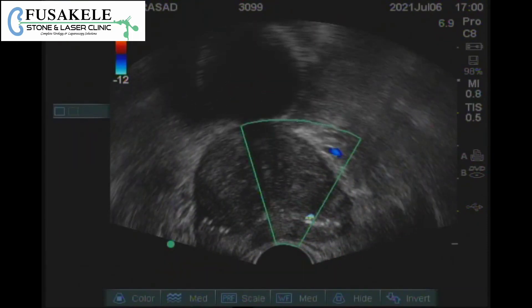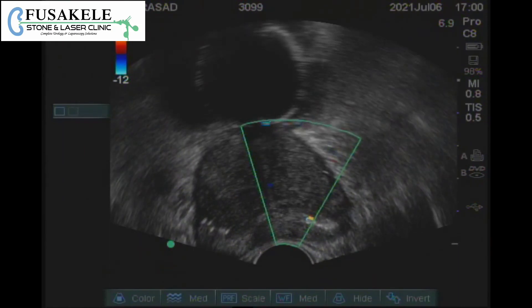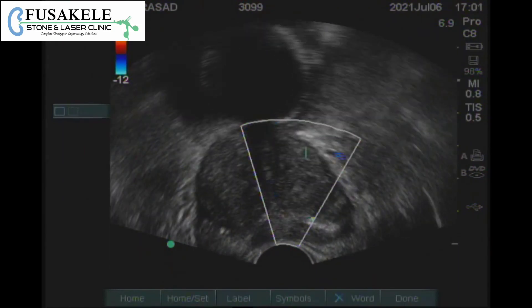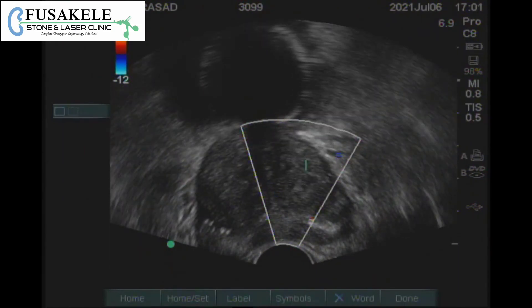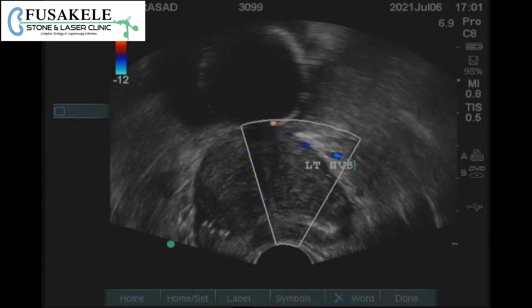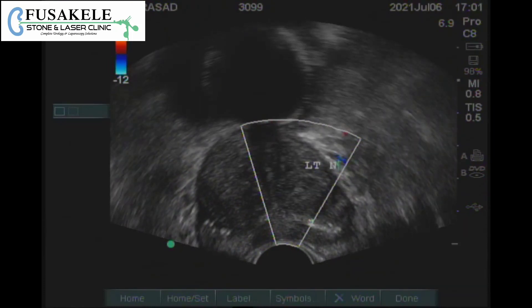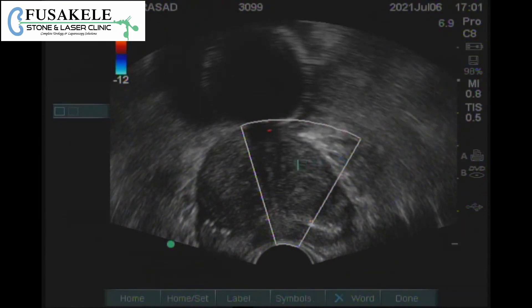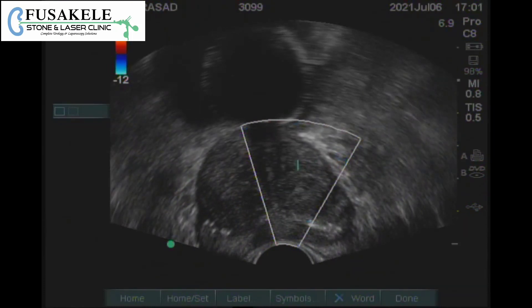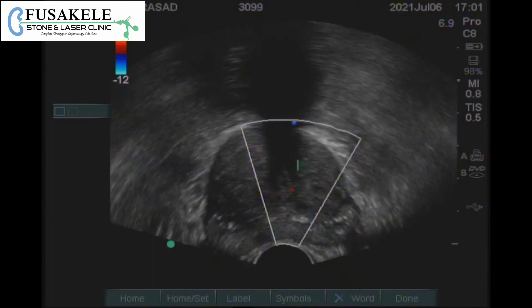This is the left side neurovascular bundle. For TRUS, a good wrist movement to see the ceilings and the floor is important to learn. An to-and-fro movement of the probe is also important.